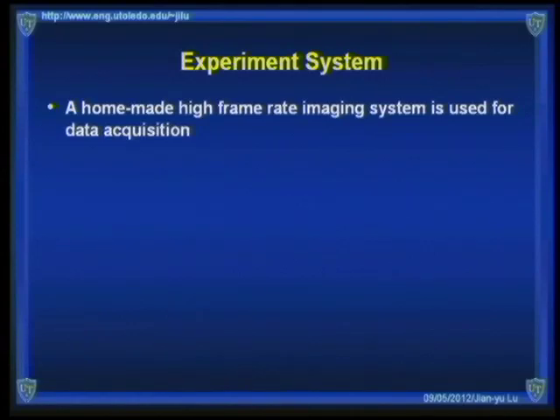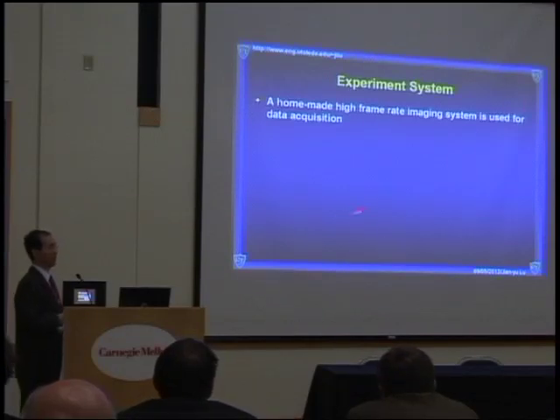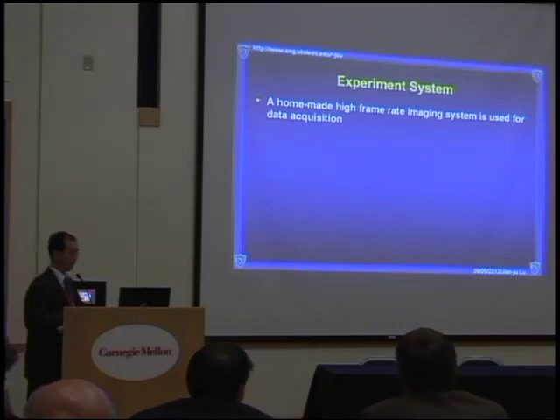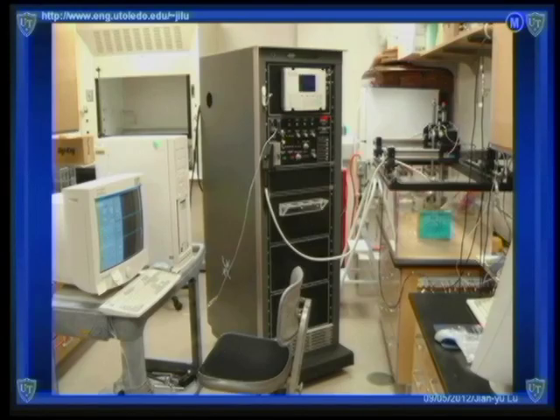We also made a homemade imaging system to reconstruct images of human beings, as well as of phantoms. This is a big equipment rack we bought for like $20, and then we pulled out all the old equipment and put our own devices and electronics inside the boxes.